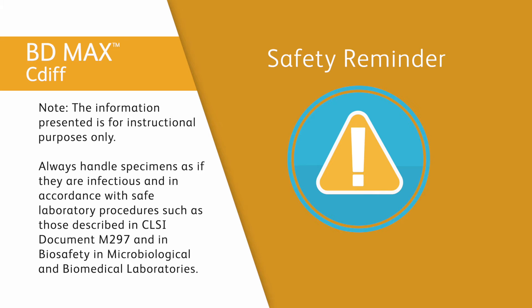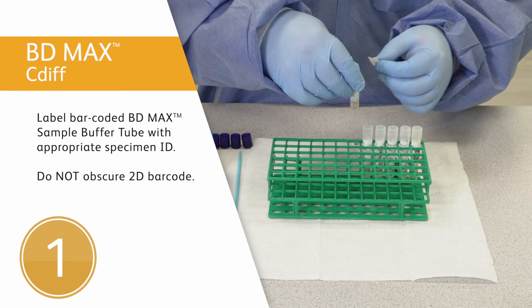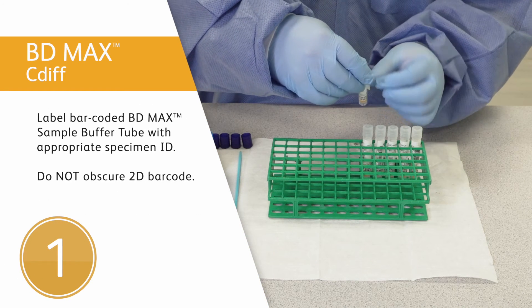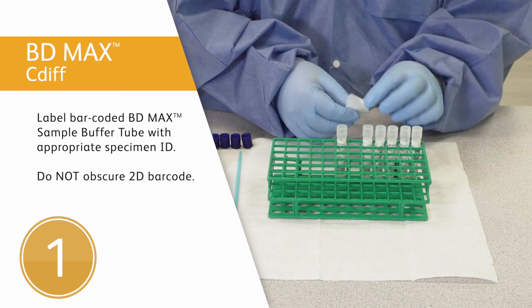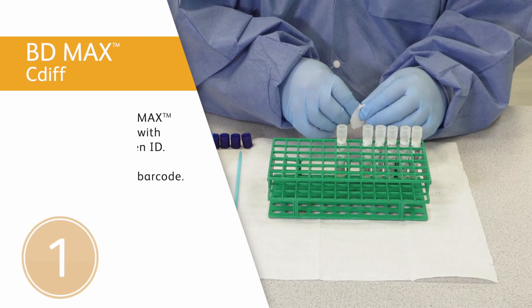To prepare the sample, follow these steps. First step: label a barcoded BD MAX sample buffer tube with the appropriate specimen identification. Be careful not to obscure, write, or label over the 2D barcode.